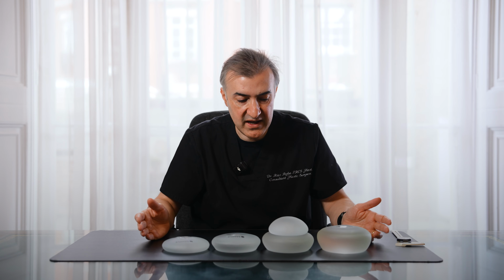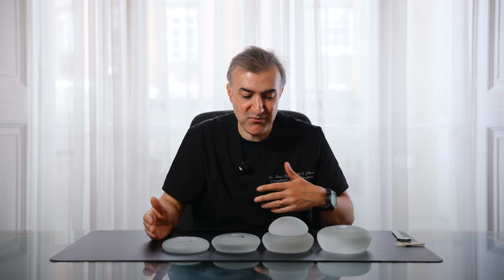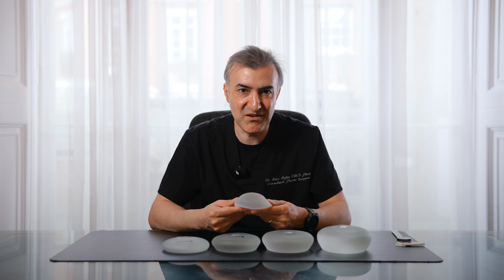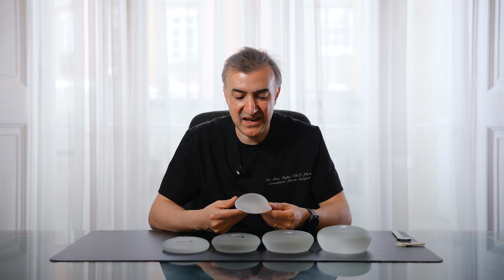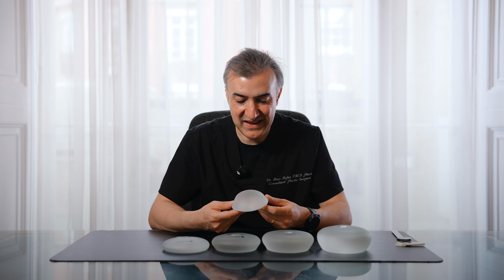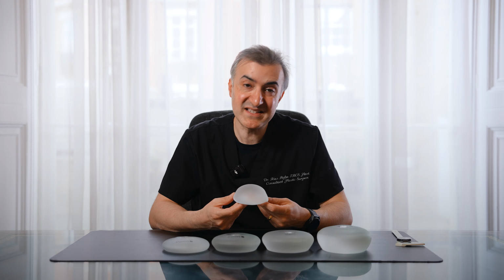But this is how you'd size patients. It's a very interesting process. It's probably one of the fun parts of the consultation where you get to try different things on. You've already made a lot of decisions by this stage, so now you're just focusing on almost the last thing, which is what size you want to try. And that's a fun part of the process, and we always look forward to doing it, and patients often have a lot of fun as well if they've got their friends with them. Then it can be an entertaining part of the consultation, giving a bit of light relief to everything else, so it's quite a lot of fun. But that's how we size patients.